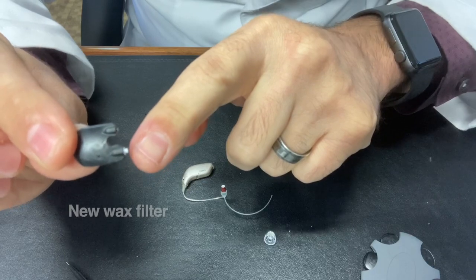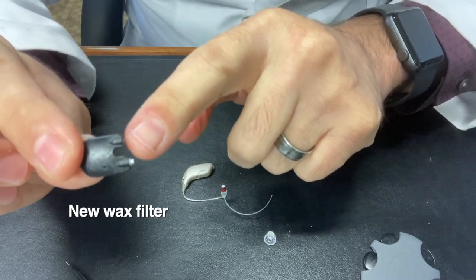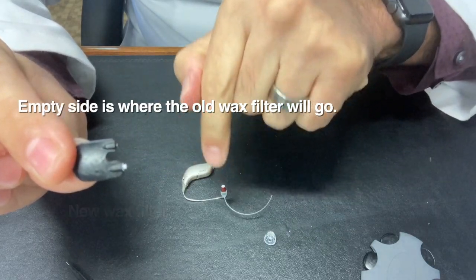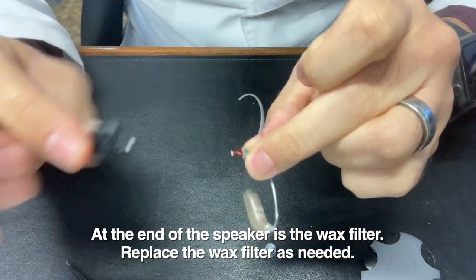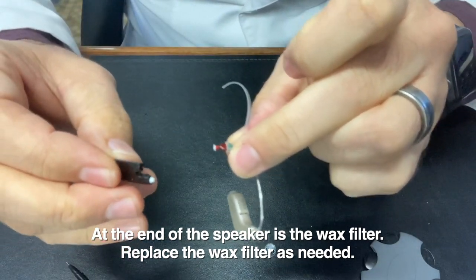That little white piece is the new wax filter, and the empty side is where the old one is going to go. So we take this device. You hold the speaker. That's this part right here, it's called the speaker.